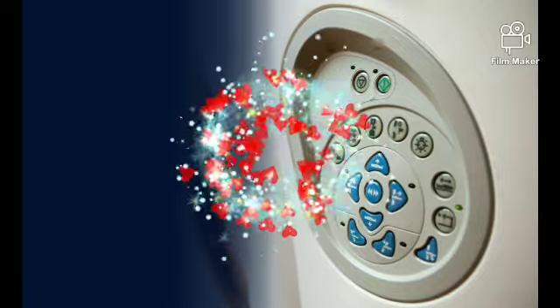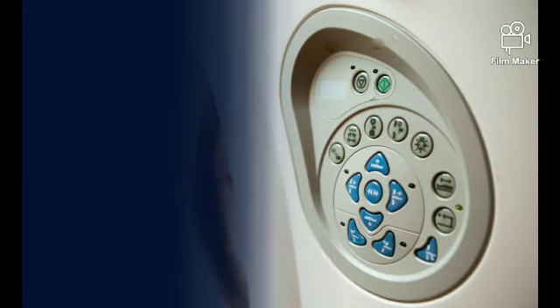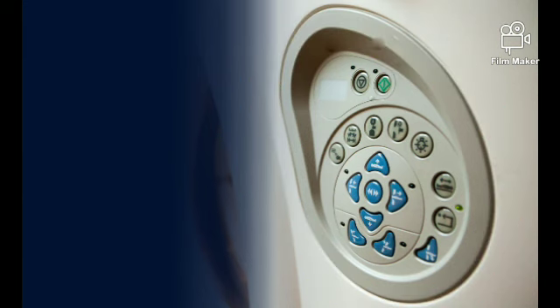And today we are going to discuss the various points we have, what their functions are, and how we know at what time we have to operate them. So let's move on. This is our CT gantry control panel, and it is present on both sides. Let's see now what each point means.